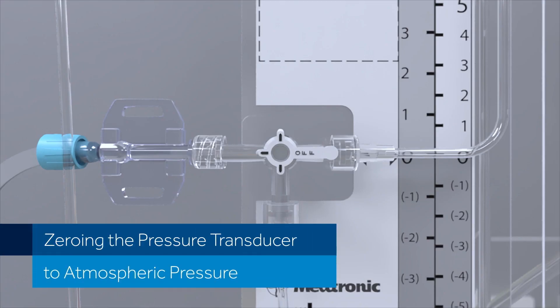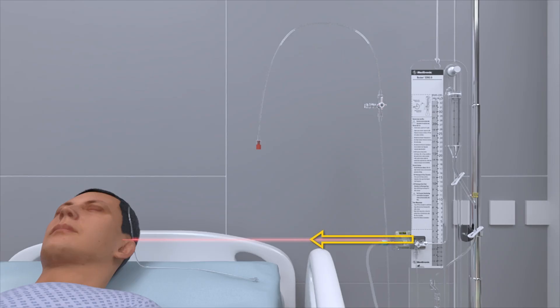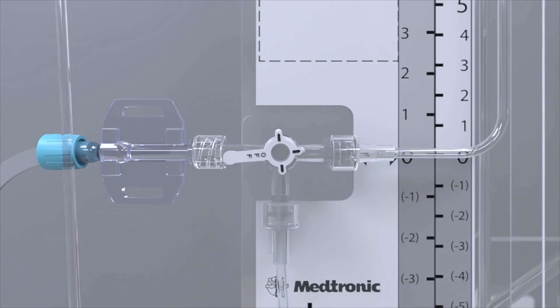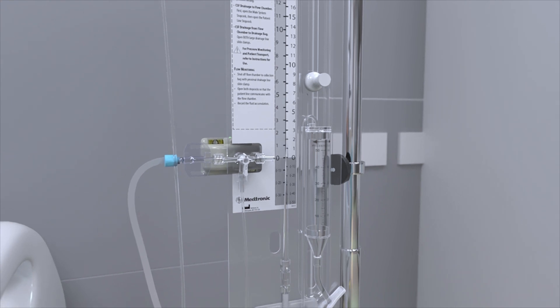Zeroing the Pressure Transducer to Atmospheric Pressure. Before zeroing the transducer to atmospheric pressure, it is important that two conditions be met. One, the drainage system should be level with the patient. Two, the tubing between the transducer and the top of the drip chamber must be completely filled with fluid. Start by rotating the knob on the main system stopcock so that it is turned off to fluid coming from the patient. Lower the drip chamber so that the arrows on the drip chamber line up with the zero reference point on the system panel.